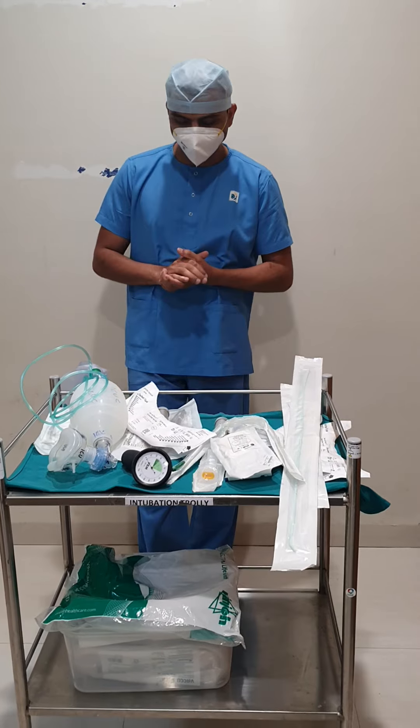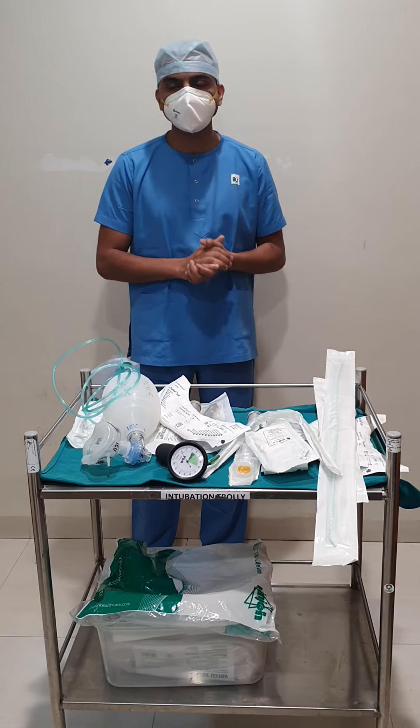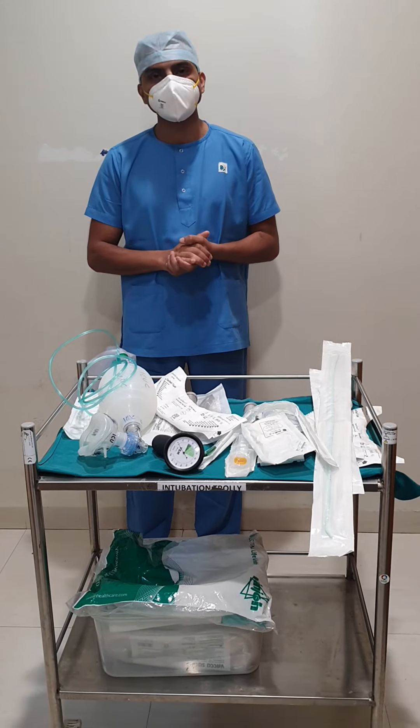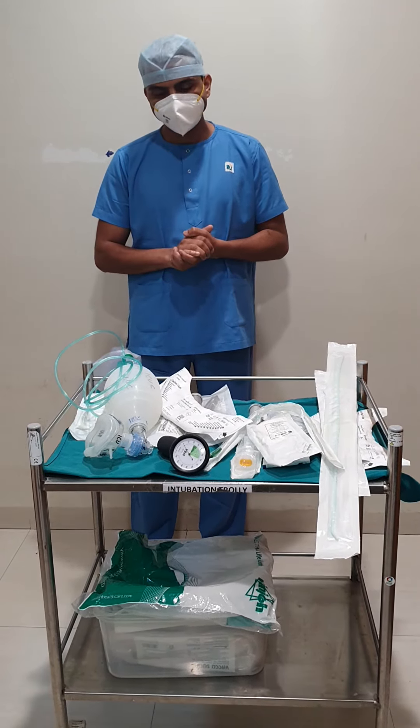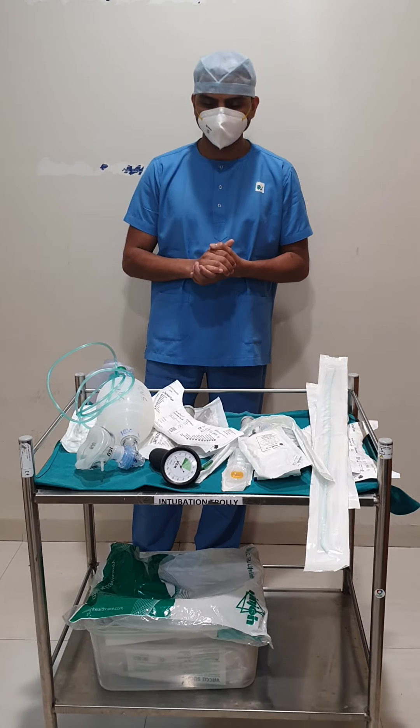These are the equipment which we require for an intubation. Apart from this, you will be administering some paralytic agent — that is rocuronium — and midazolam, which is the sedative agent. This is all about intubation and the articles needed for the procedure. Thank you.